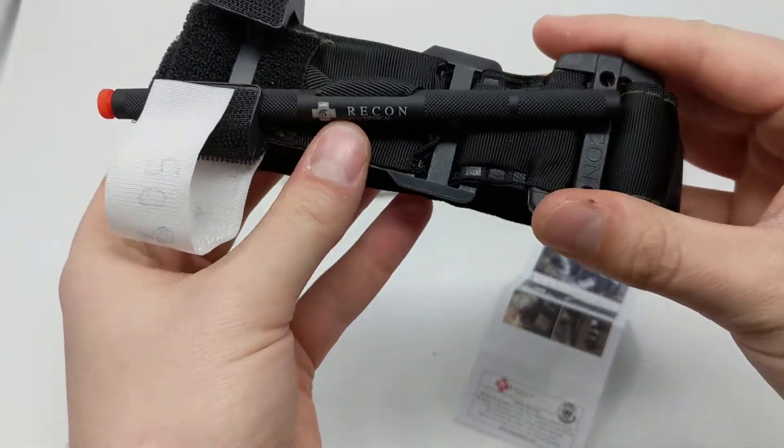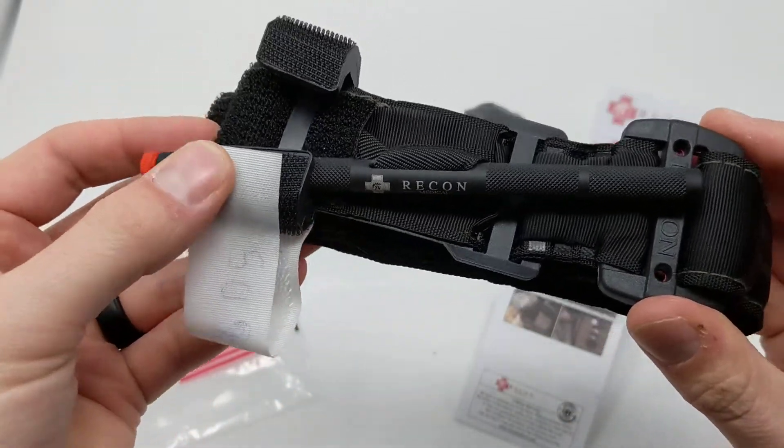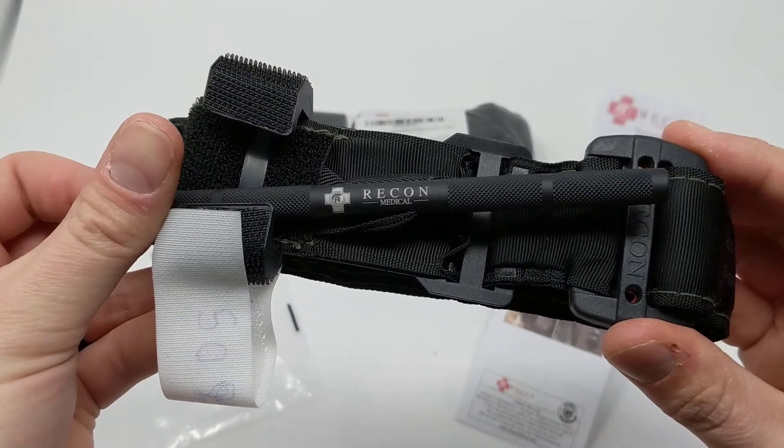So this is our Recon Medical Gen 4 Tourniquet — brand new 2020 product — and it's now available at wildmedkits.ca.